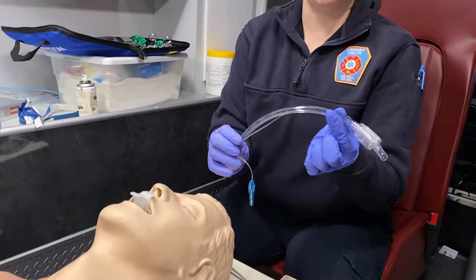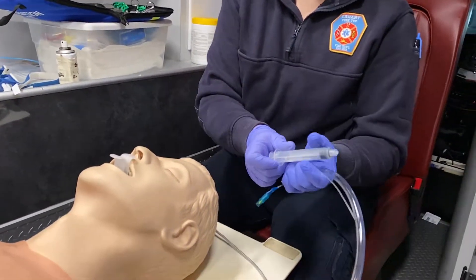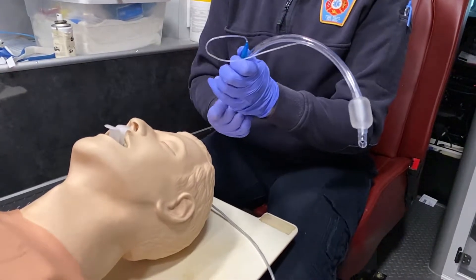First I need to select the proper ET tube, which we found over in a previous video. I do need to check the balloon at the end of the tube to make sure that there are no holes, tears, or leaks, and that it inflates well.